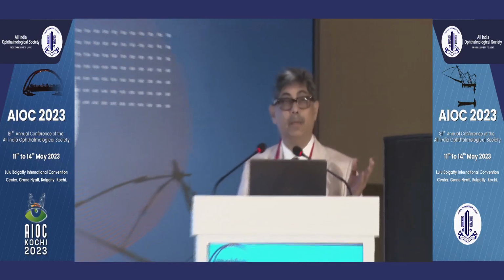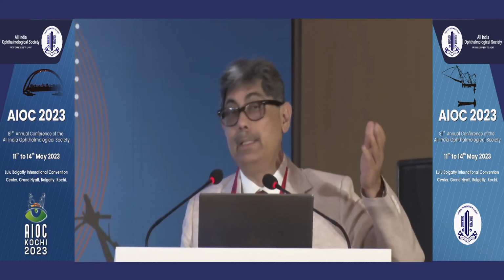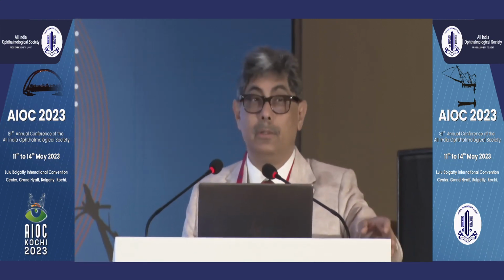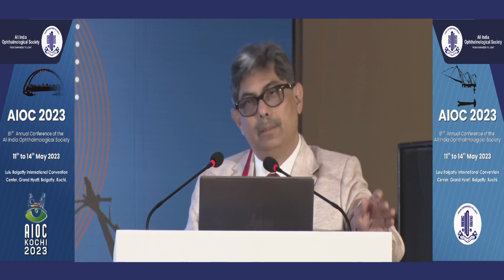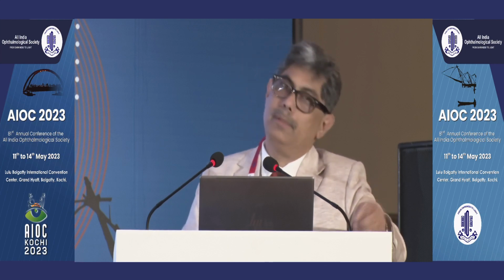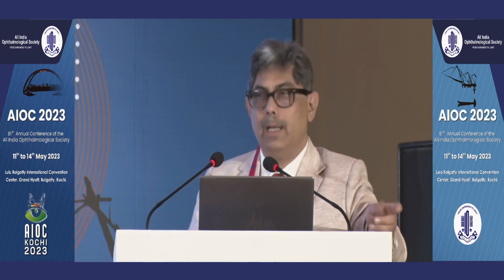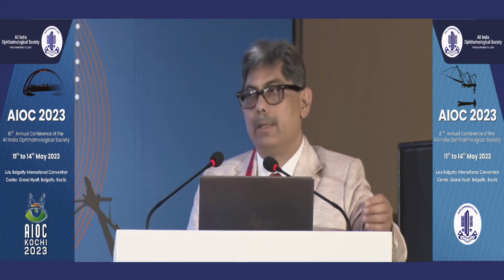We did it, and then we see those patients. Although during those days the central opening was also not there, the vault is still present, and no development of cataract is there, but definitely the incidence of cataract with the earlier type of lenses was high, and we come across cases of cataract in such eyes now.